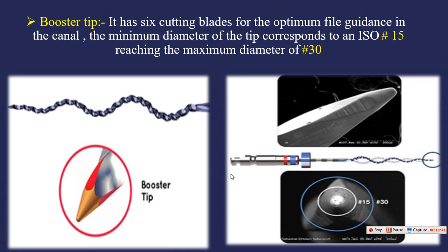As seen in this picture, the small ring is the taper. This red ring means 0.04 maximum, with this large ring for size. As we know, the ISO size blue is 30, so the maximum reached is ISO 30 with taper 0.04.